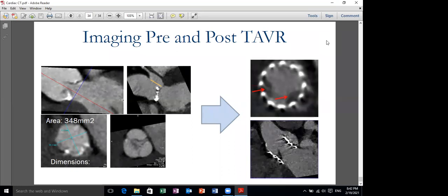لكن بعد في شوية modification أحيانا في الكوروناري اكتيزيا، ودي ممكن يبان حتى في ال non-contrast enhanced study مع الكالسيوم score. If the vessel is much ectatic you may inject even with higher calcium score لأن ال diameter بيبقى very large، ومع الاكتيزيا معظم الكالسيفيكيشنز بتبقى في الوول، بس طبعا ده اكسبشن قوي.